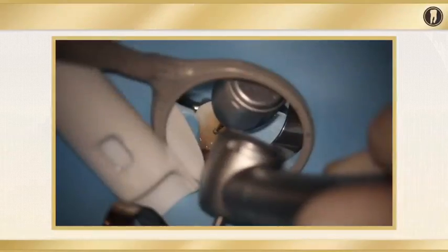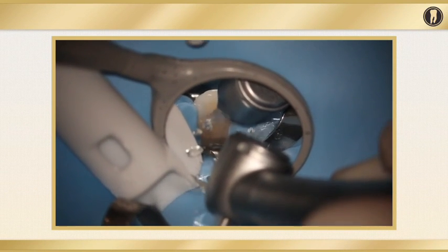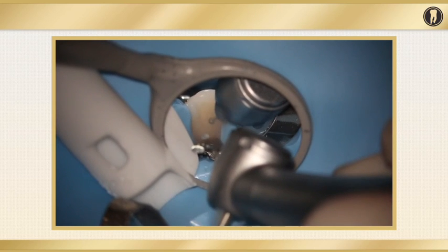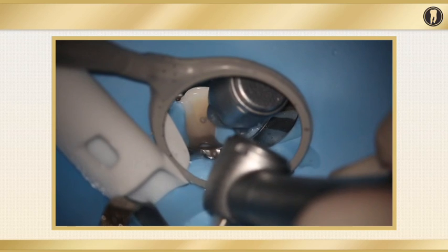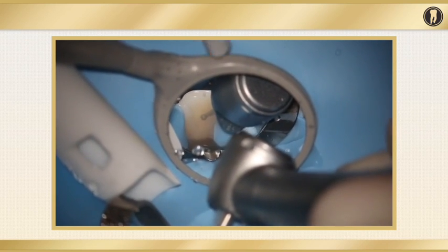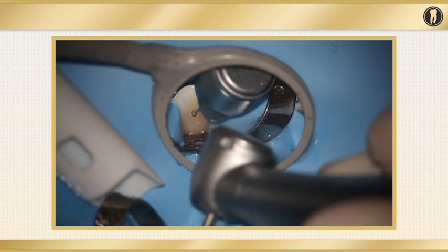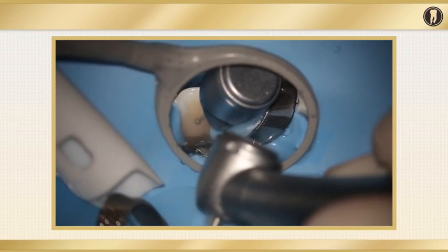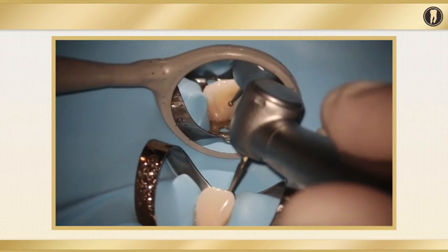Now I want to show you a video as an example of our anterior access. Here's a case where I am accessing tooth number 10, and I'm starting with a number 2 round diamond. This is a great burr. You can see that I have the water on, so I'm initially starting my access with the water, like I stated before. And as I get a little deeper, you're going to see that I turn the water off, and I will continue with this burr to penetrate into the pulp chamber.